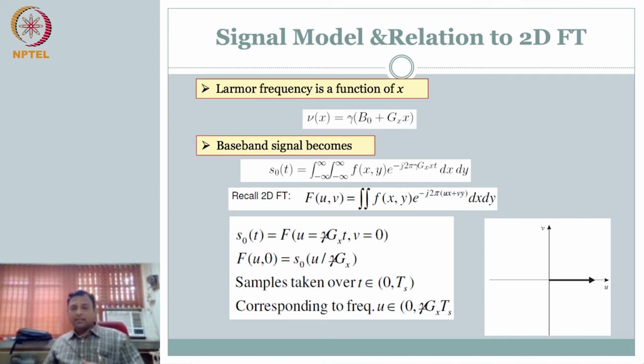Fantastic, right? Now you recall something similar we did when we did 2D CT. You had a detector array and a famous theorem, the Fourier slice theorem. You have a detector array, you measure the signal, take the Fourier transform. The Fourier slice theorem said this is one slice in the 2D Fourier transform of the object. So then our entire concept changed.